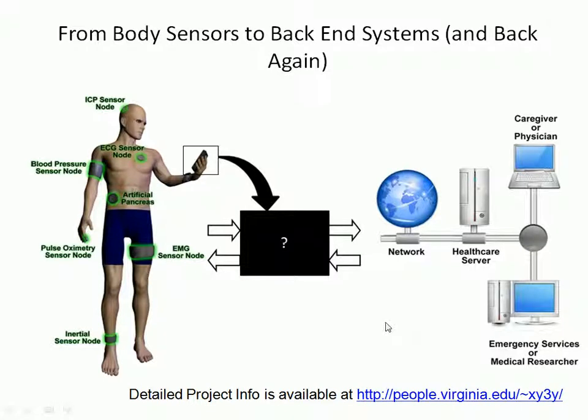Here is our DESI telemedicine system. As you can see, at the front end, we have multiple sensors on a patient, and at the back end, we have caregiver, physician, and emergency service. We are using a server in a hospital to receive data. So our DESI, Dynamic EHR-Sensor Interface, is in the middle here, running on a handheld device such as a smartphone, PDA, or netbook.